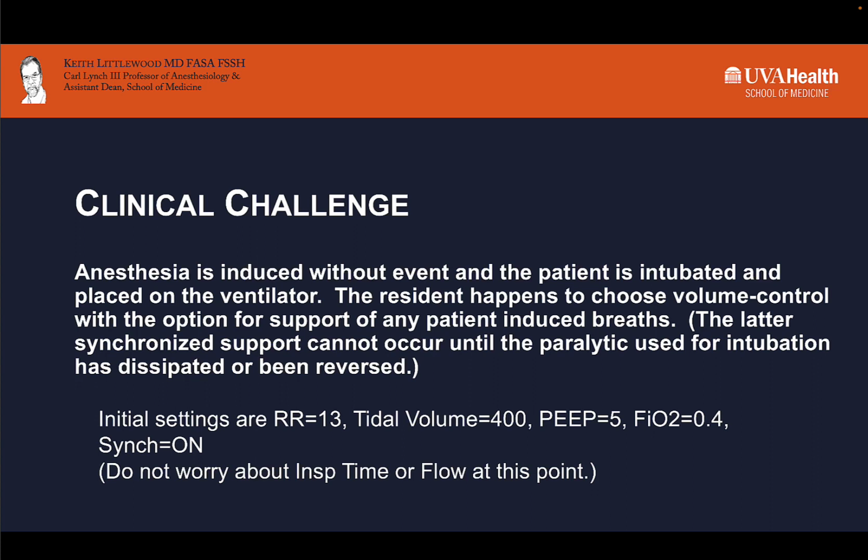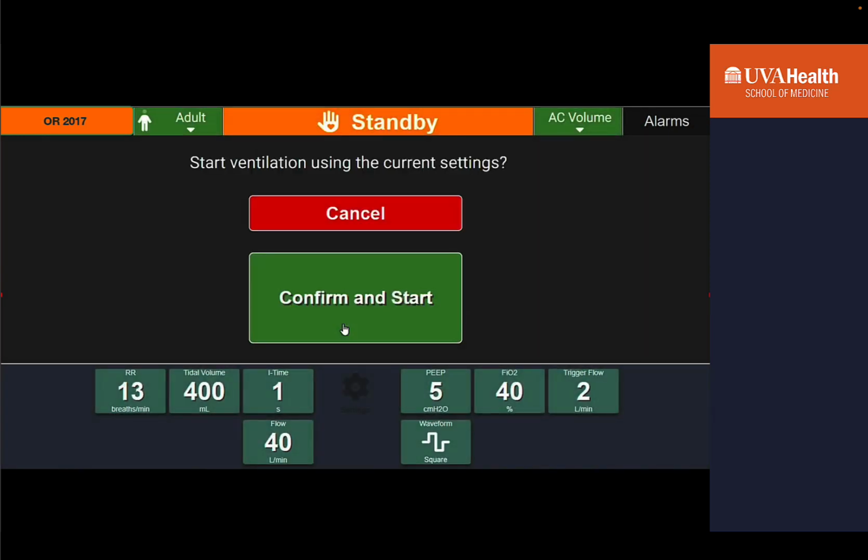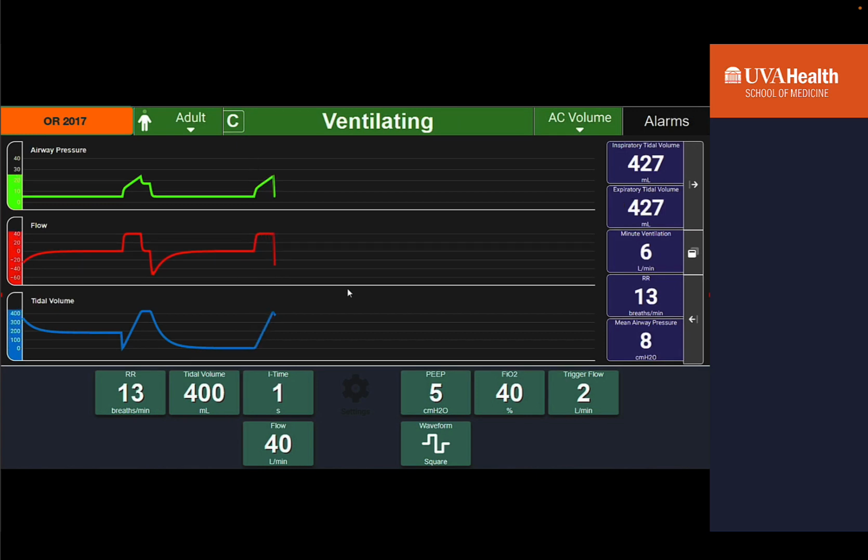I'm going to give you a representation of a ventilator, and there are several different interfaces. So this is not the only type of ventilator or parameters that you'll see in your clinical work. We've intubated the patient. Our circuit test looks good. And now we go from handbagging to mechanically ventilating the patient. These are the settings.